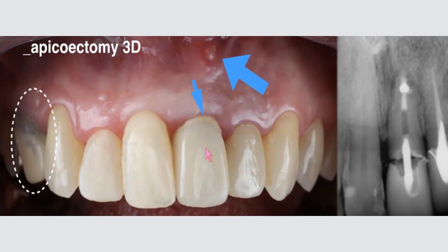Of course, we need to change this restoration. There are some issues on this premolar on this side and so on. But anyways, this is what really needs to be taken care of urgently. And of course, we did it in combination with a temporization, a better temporization for this patient. So the X-ray shows us that situation here.